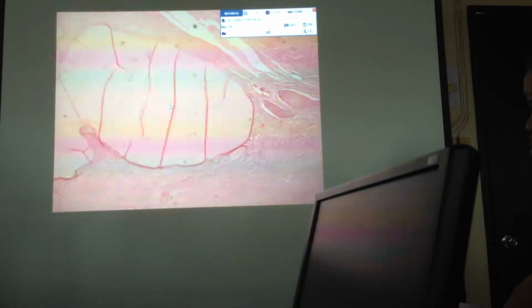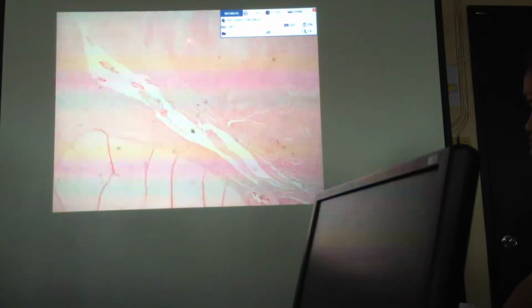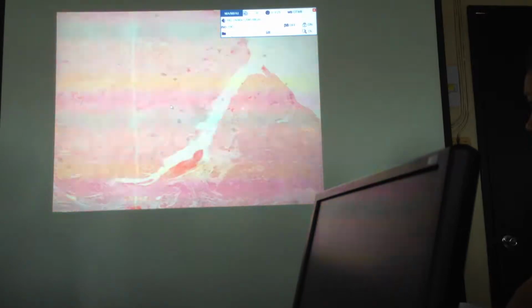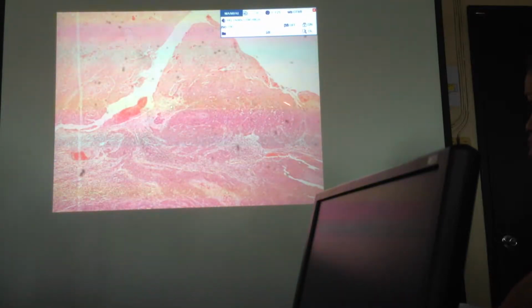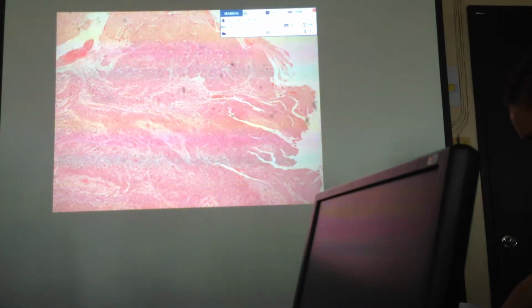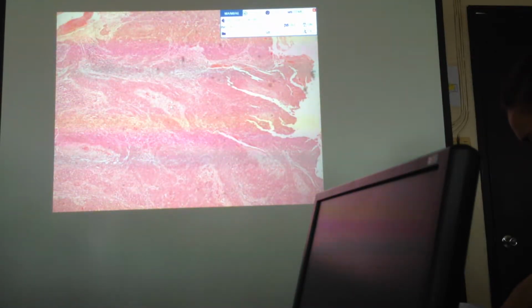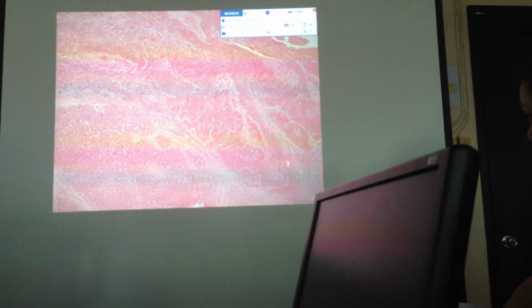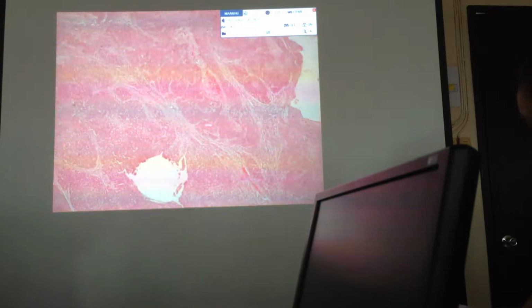Notice that you still have glands over here, and then you have the atypical cells over this portion. Okay, so squamous cell carcinoma is associated also with the human papillomavirus, same as that of the carcinoma in situ. You would see the presence of nests of atypical squamous cells.